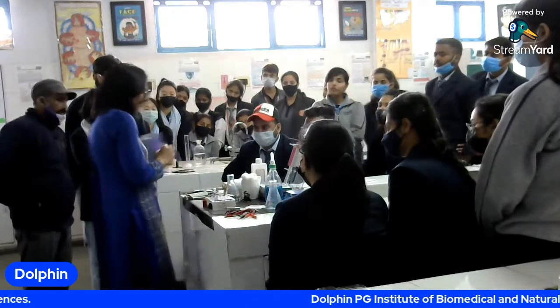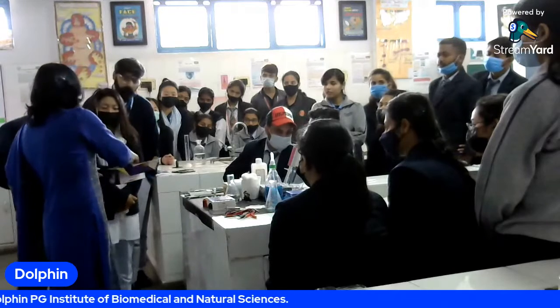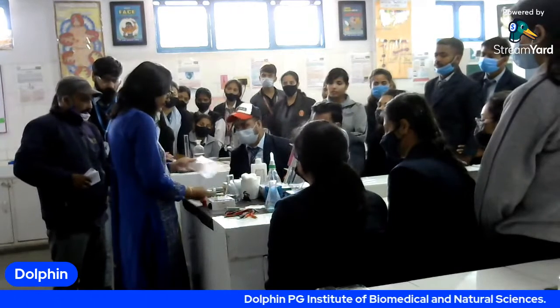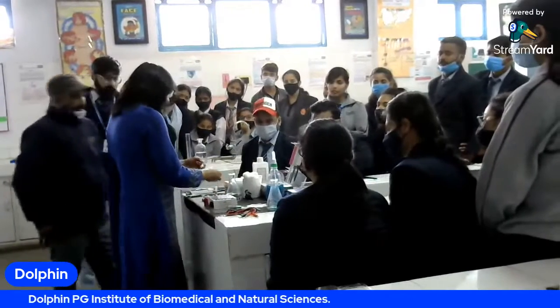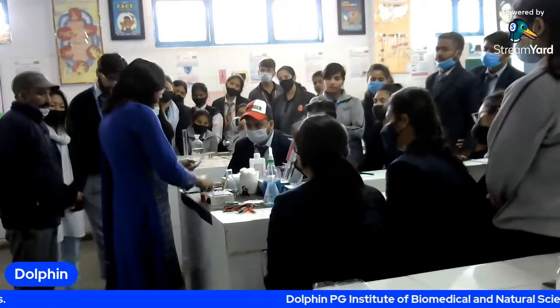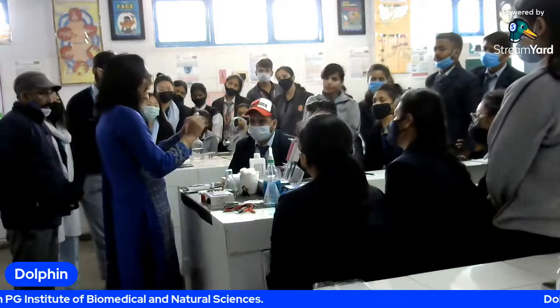The kit contains the antigens, they are the standard antigens, antigen 1, 2, 3 and 4. Then there are the sample antigens.